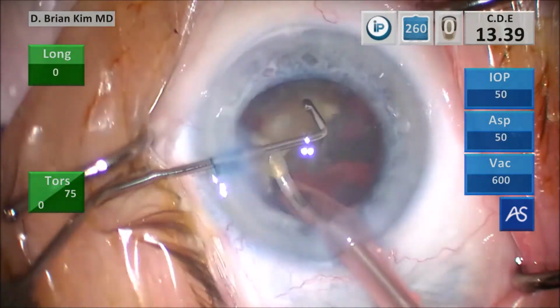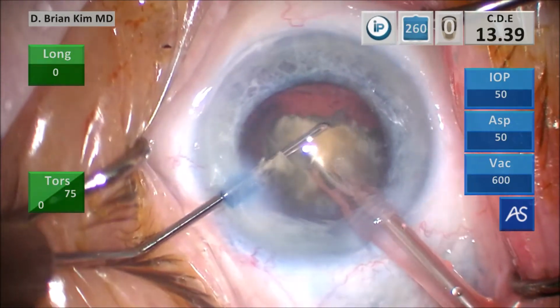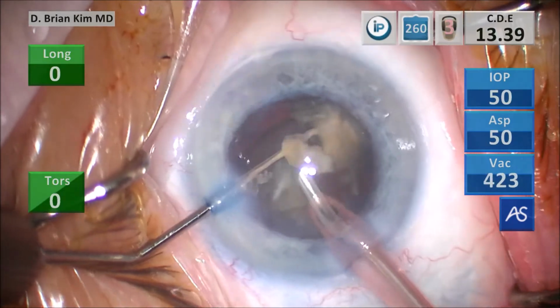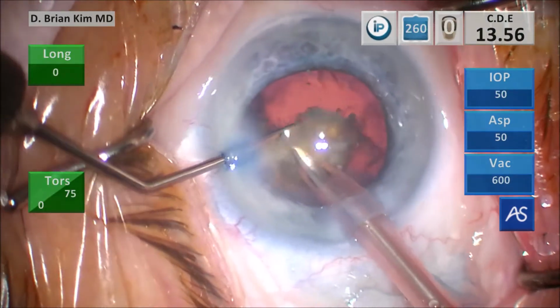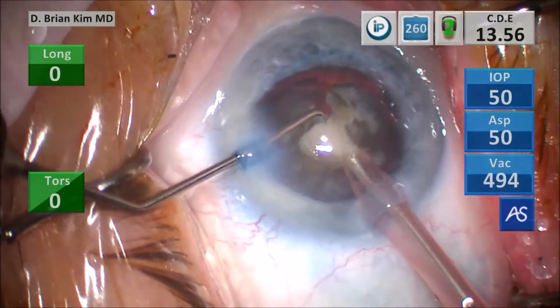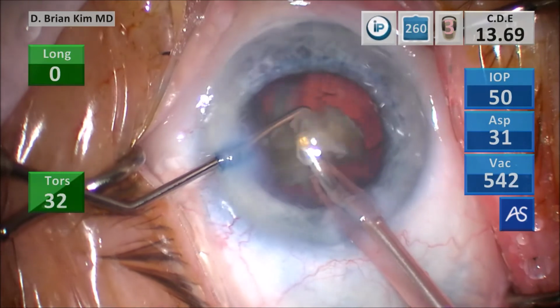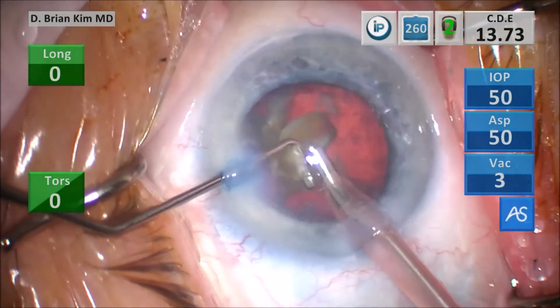By always going after the piece with the chopper and hooking the peripheral lens, I never struggle. I don't have to go after it and then can't get purchase, and the vacuum won't hold it. And then you try to lollipop it with ultrasonic energy and it doesn't come to you. There's just a lot of inefficiency and frustration when you do it the traditional way of trying to grab pieces.